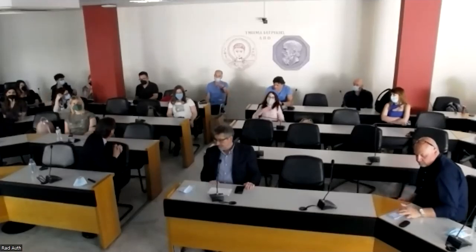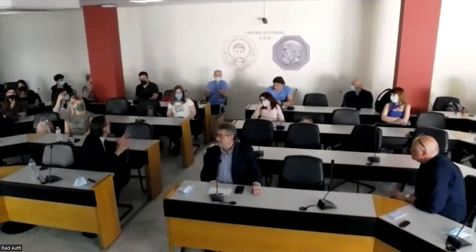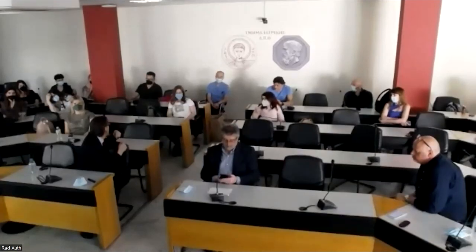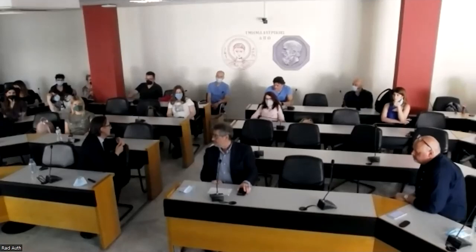Thank you very much. This extra radiation dose, is it less than the dose of an unenhanced scan? I mean, do we have any benefit? It's not so simple, because when you work with a source-based approach and you have dual energy, you have to decide before the acquisition if you want to work with the spectral approach. Because otherwise, you work with one tube or with one energy level. So the answer is not so simple, because you have to decide beforehand if you use dual energy, reducing one contrast phase to obtain spectral information.